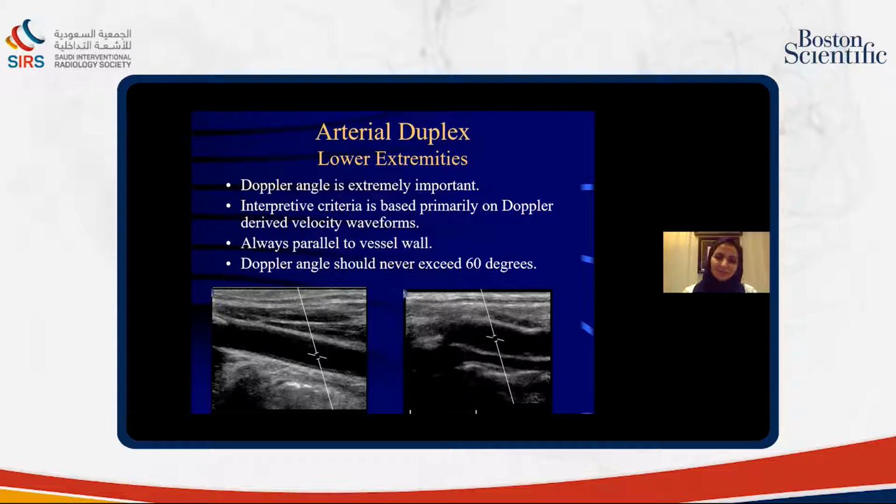Velocity, the accurate velocity when we have parallel angle to the wall of the vessels, and in the middle, and the sample volume in the middle of the vessels itself. And do not mention velocity in your report if the angle is not correct.